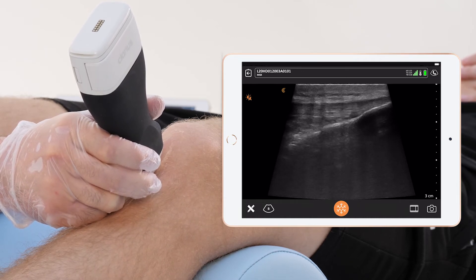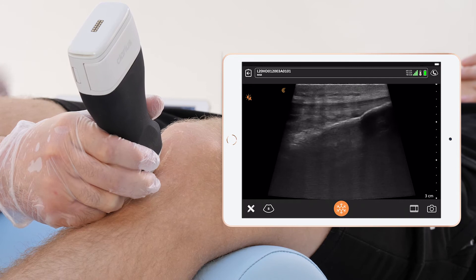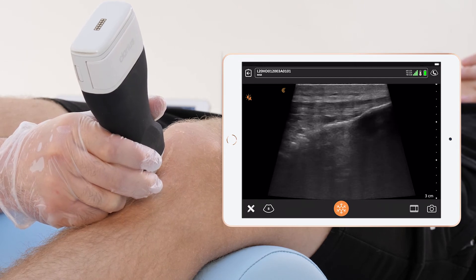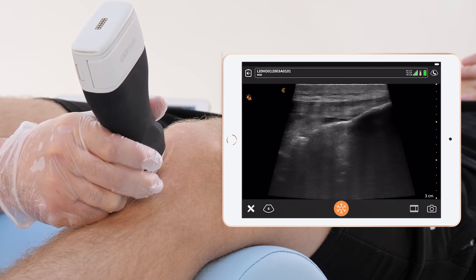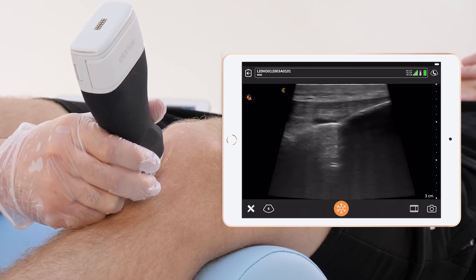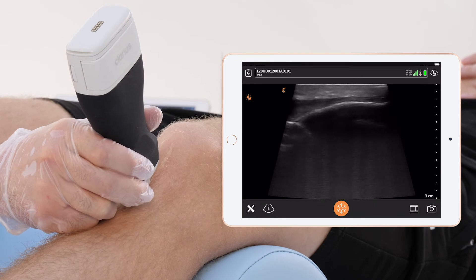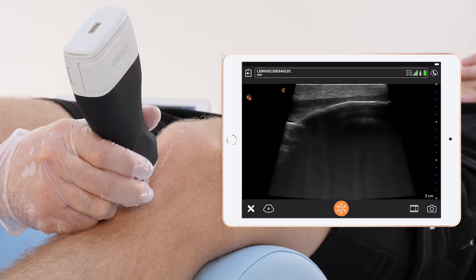In case of a bursitis you will see an enlargement of this fluid. Here you can see the typical insertion to a smooth bone.